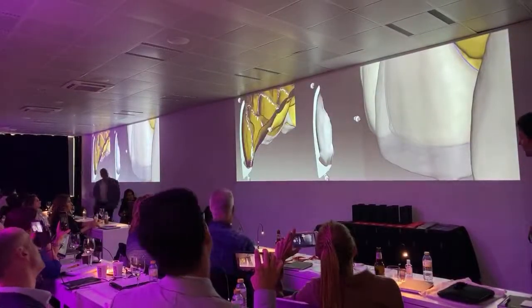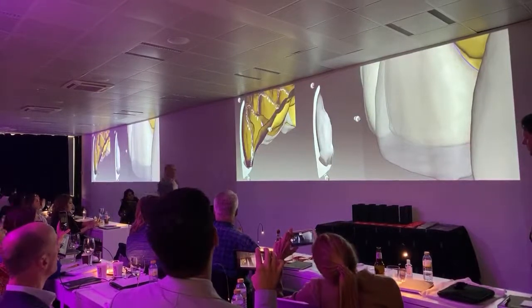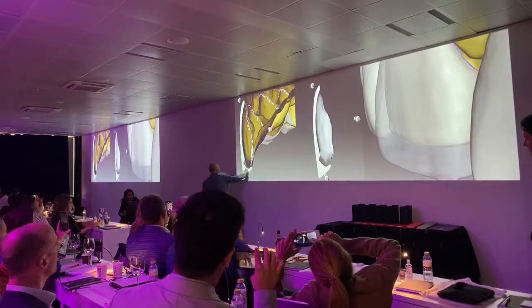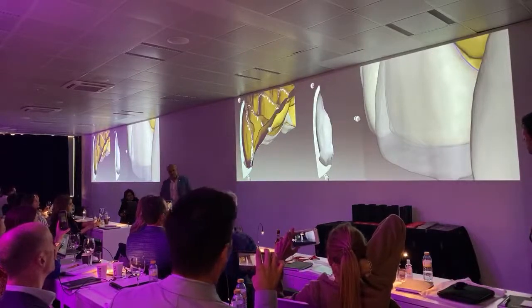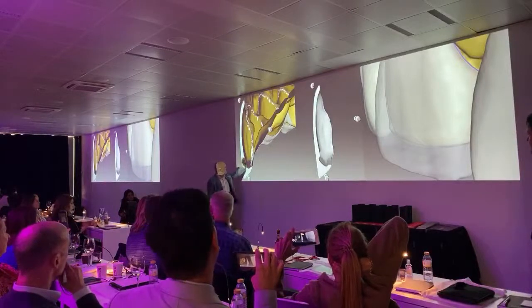Look at this example. We can see the space because of the diameter of the burr. So this is an over milling. It's easy to break here. Make sense? So if you round a little more, this will fit better.